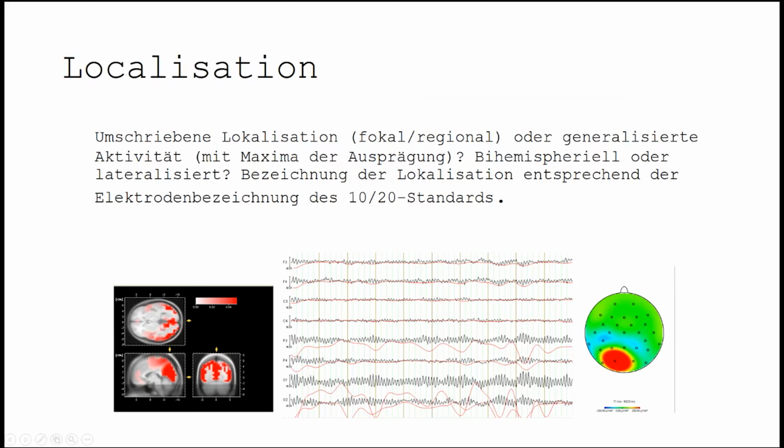Okay, so before we come to our daily case, maybe one interesting thing, and maybe we're going to dedicate a special seminar to that. But for all of you that are here for scientific reasons, it's important that we can do source localization using EEG. So all we saw now is the electrode traces in the 2D picture. And you see F3, the electrode recorded that signal, C3 recorded this signal, and so on. And we can see it here on the right side on the placement from above.